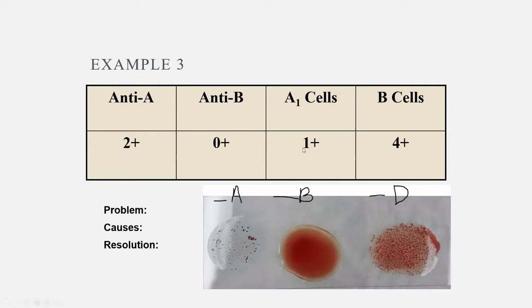So if you have an anti-A1, it's normal for A2 phenotypes to have it or not to have it. That's in the ABO discrepancy homework. That's why plus or minus was an answer. So for example, an A2 could be plus or minus. It's common both ways. They may or may not.